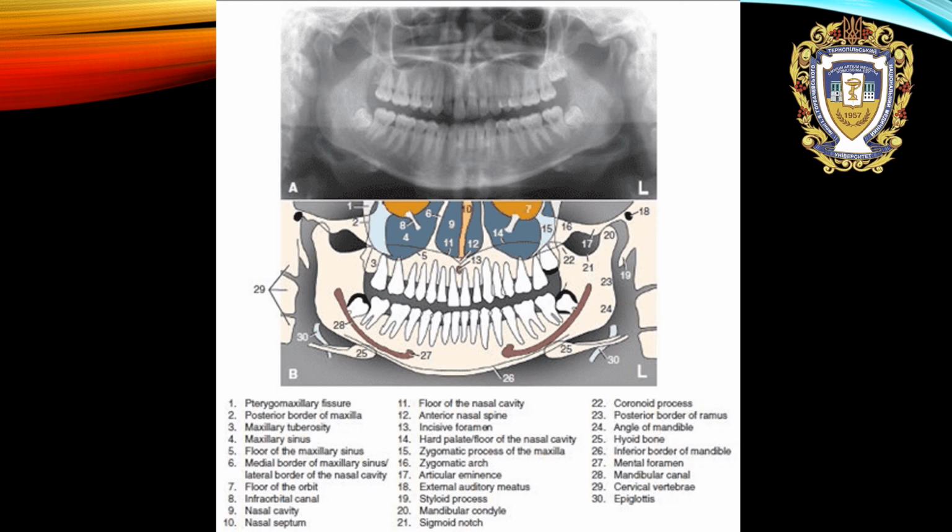On this slide, all those structures are shown schematically. Please look attentively.